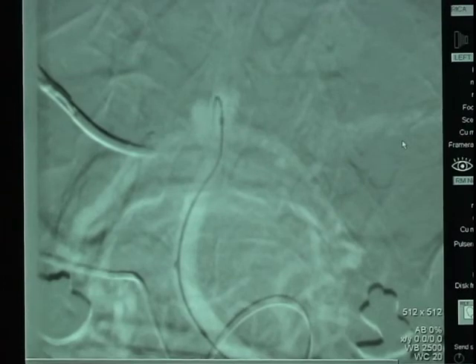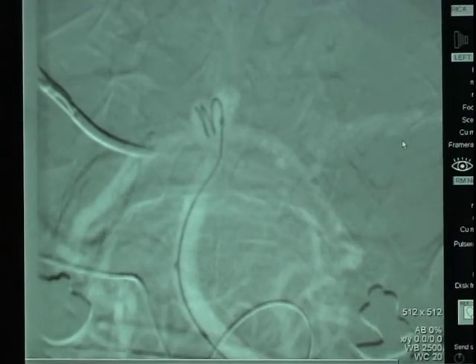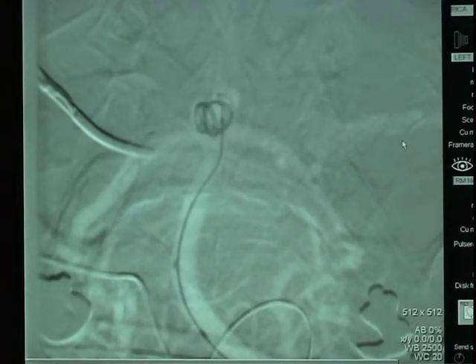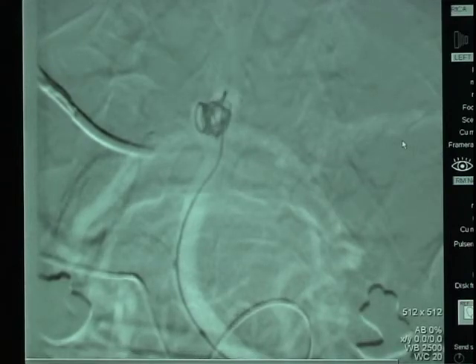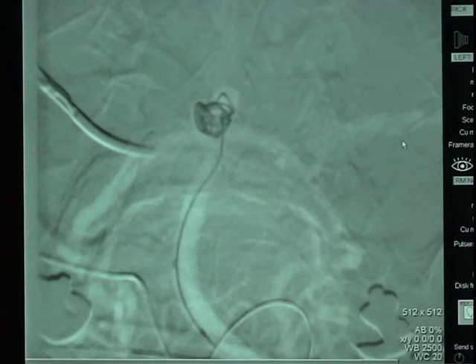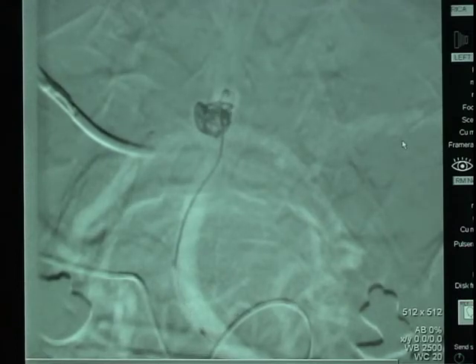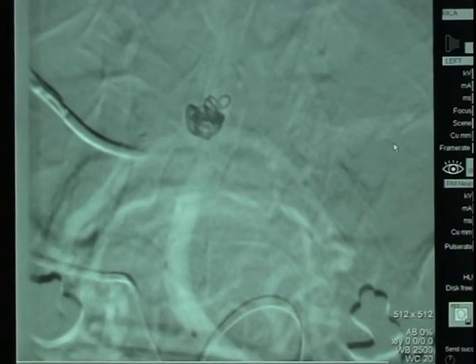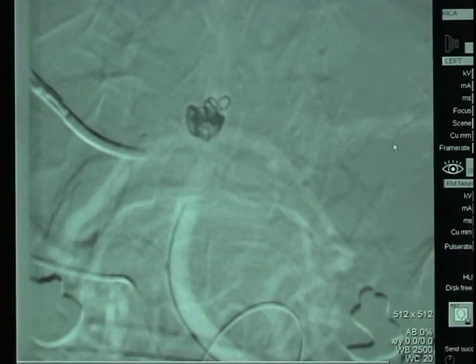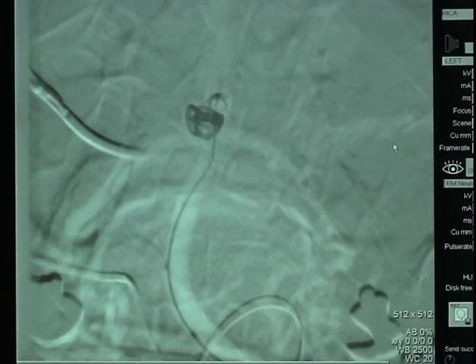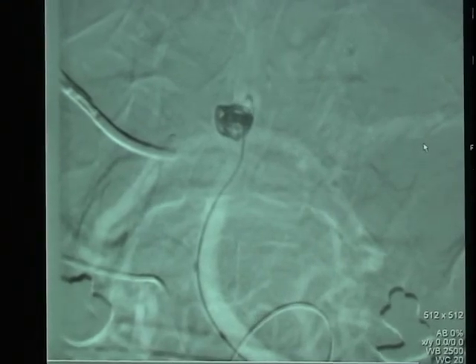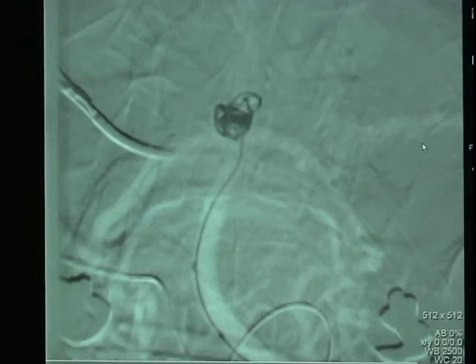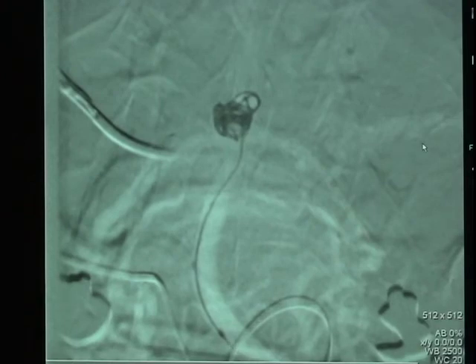We are now advancing a different coil, downsizing from the previous one. The coil is advanced through the microcatheter into the aneurysm, and the two neck remodeling devices keep the basilar artery and the posterior cerebral arteries patent. The dome of this aneurysm overlies the branch points of the posterior cerebral arteries, so it will appear as if there is coil actually within the basilar artery itself, but in fact it is held out of the basilar artery lumen and the posterior cerebral artery lumens by the deployed neck remodeling devices. Here additional coils are being placed within the aneurysm.